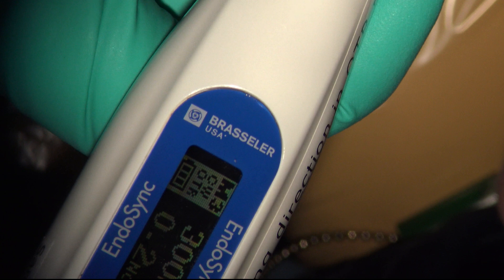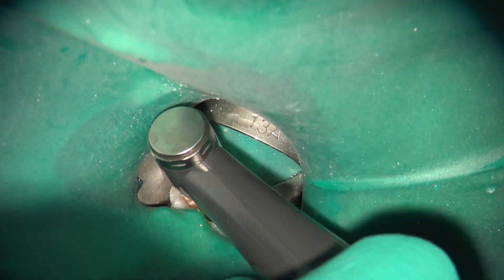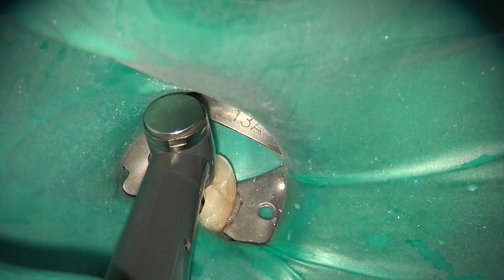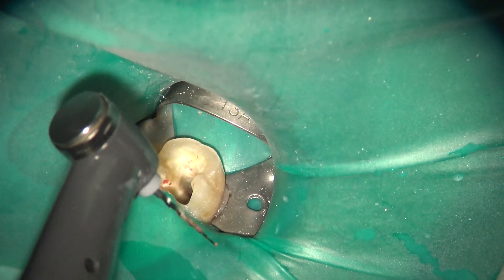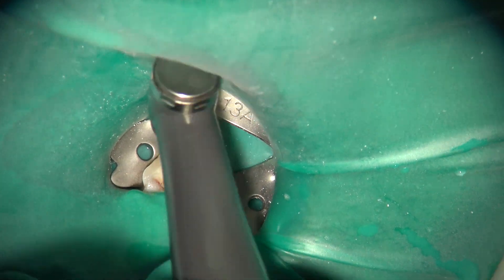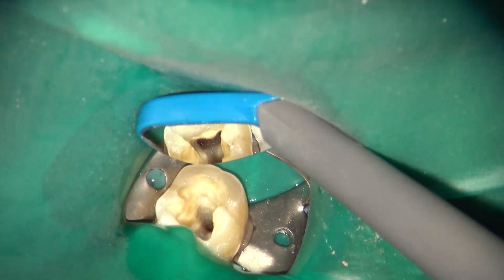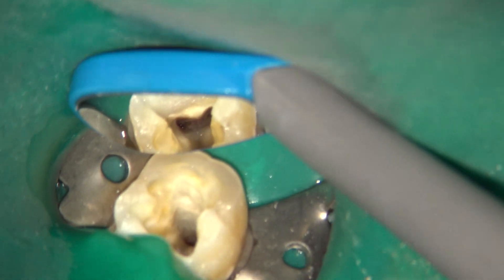I'm using the EndoSync here, set at 300 RPM and a torque of 0.2. You can use a higher torque if you want — you can actually use these files almost for reciprocating in a forward direction if you set the torque limit pretty low to 0.2. So, 300/0.2 or 300/0.6 if you're more experienced in molars, and you can go to 500 RPM in anteriors and premolars. As usual, we start with the SX, which is the orifice opener, to open up the top. It's very important to have straight-line coronal access, eliminating any potential coronal restrictions.